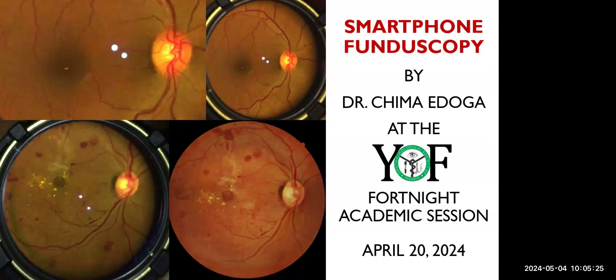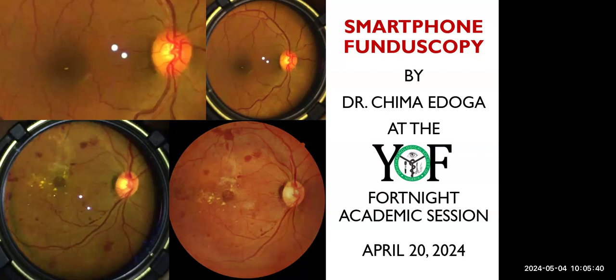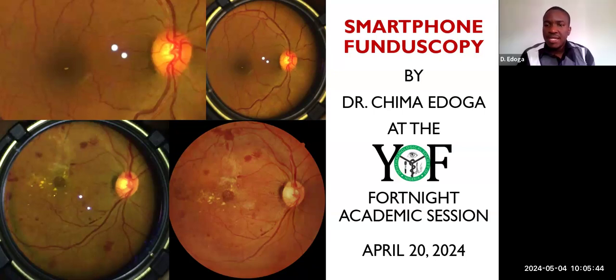Thank you very much, Dr. Bature. I've used Peek, the adapter itself. Are you talking about the app? No, the Peek Retina adapter. Okay, adapter. Yes, I've used the Peek Retina. It has a limited field of view. I think it has about 9 to 12 degrees, if I'm not mistaken.